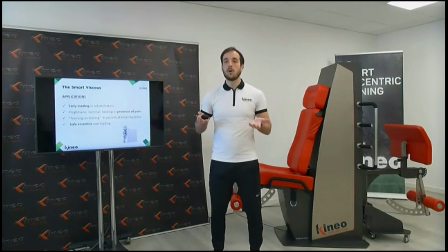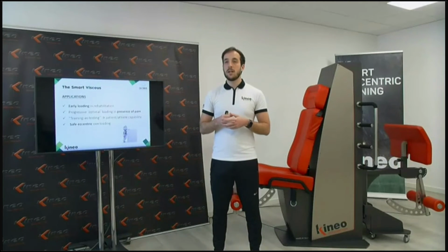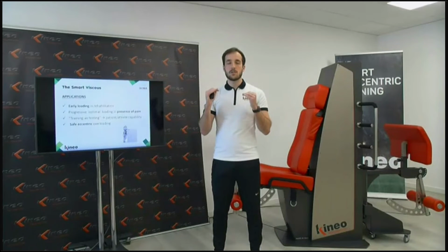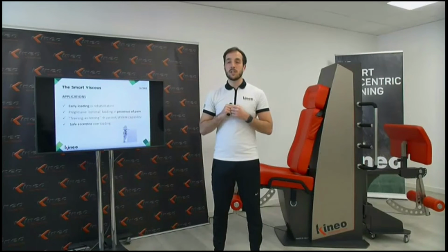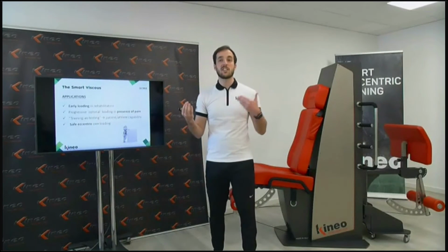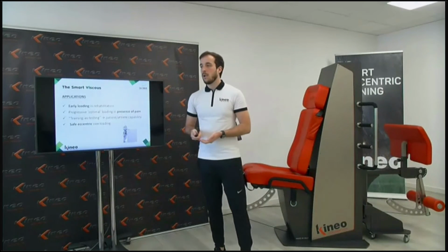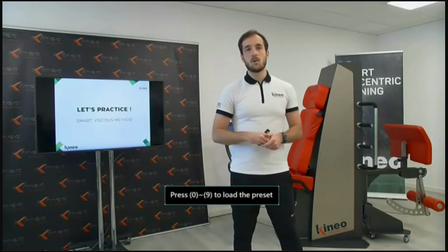If you can afford 80 kilograms, the initial load of 80 kilograms from before, the machine adapts the load to what you can resist in eccentric. So in concentric, it gives you more load if you increase your speed. In eccentric, it decreases your load if you increase your speed. If you increase your speed, it means you are not decelerating well. If you're not decelerating well, it means that your eccentric capability is not trained enough for that kind of load. So let's practice. We'll have a very quick practice because we are running out of time.